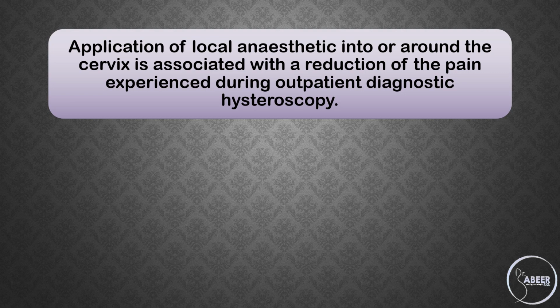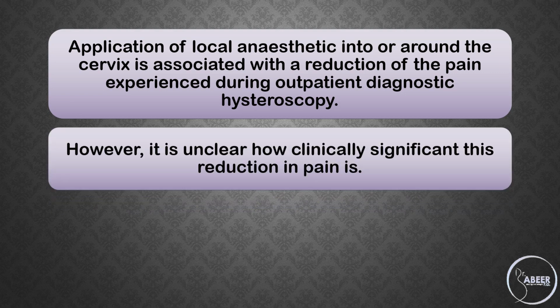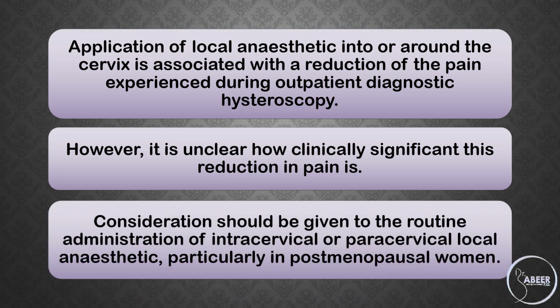Application of local anesthetic into or around the cervix is associated with a reduction of the pain experienced during outpatient diagnostic hysteroscopy. However, it is unclear how clinically significant this reduction in pain is. Consideration should be given to the routine administration of intracervical or paracervical local anesthetic, particularly in postmenopausal women.